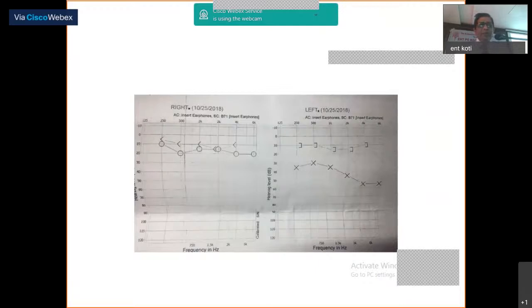So the recordings which you get in a normal condition are air conduction and bone conduction. Most of the time they overlap, and if you find an audiogram in which the air conduction recording is above bone conduction, you should never trust that, because air conduction is always below on the audiogram.